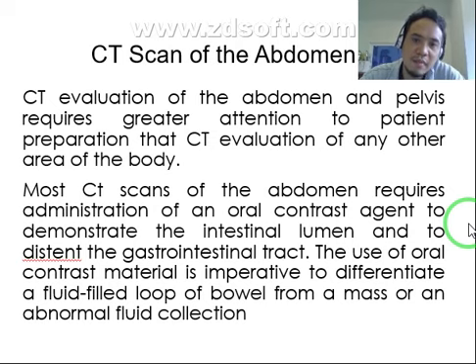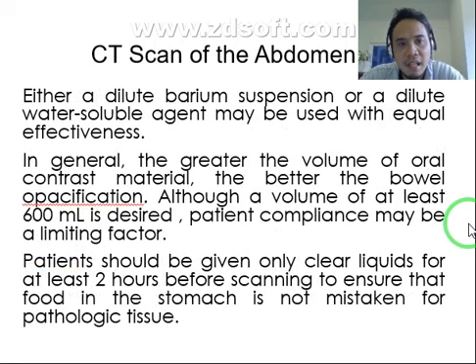But kung wala may barium suspension, we can use water as our negative contrast media to delineate the so-called pathologic condition. Okay? Either a dilute barium suspension or a dilute water-soluble agent may be used with equal effectiveness. Pwede ta magamit og dilute barium suspension or kaning water-soluble or iodinated contrast media, kay pareha na sila effect.